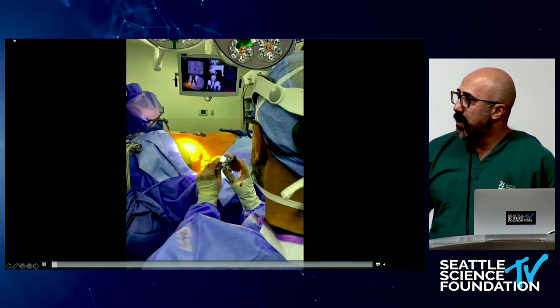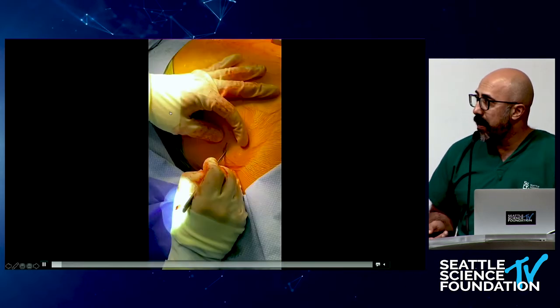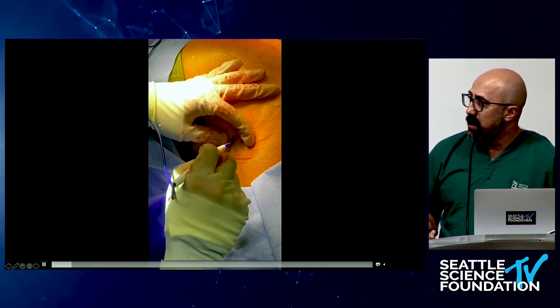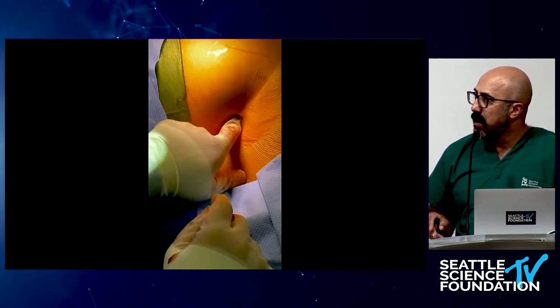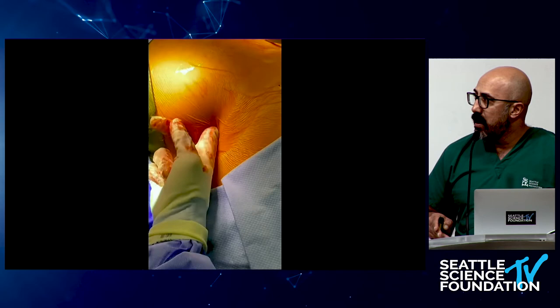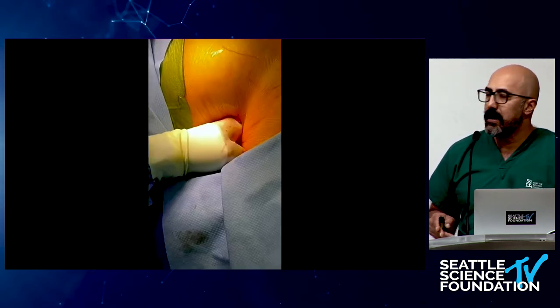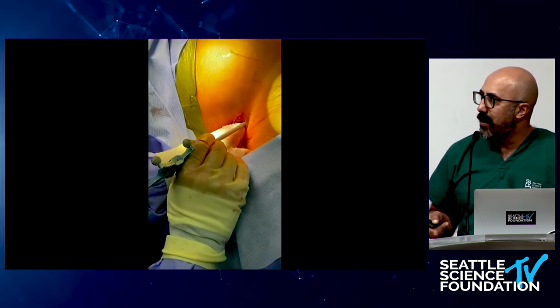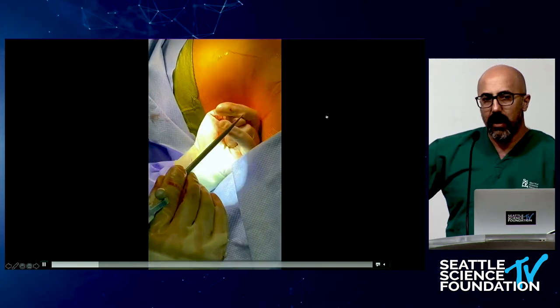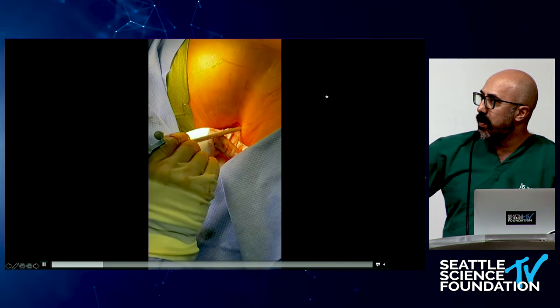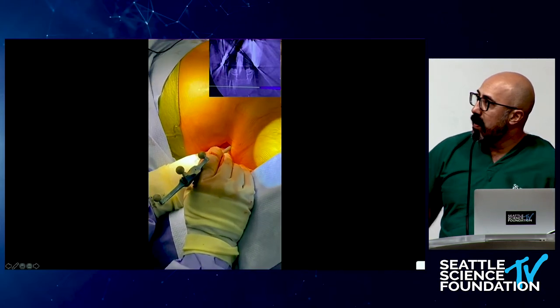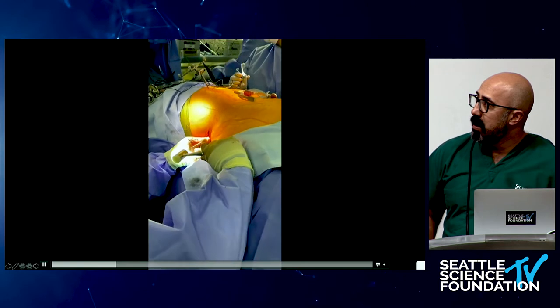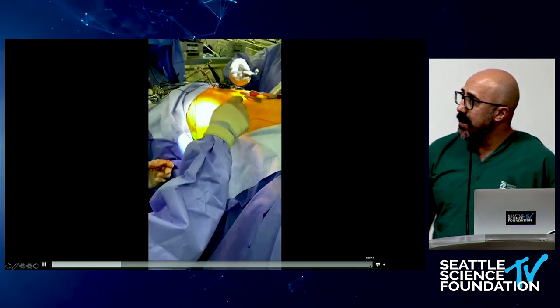I plan out the incision just like normal — this is a fairly large patient, working at L4-5. I come in doing blunt dissection through the skin. I treat this like a normal XLIF or normal lateral, blunt dissection all the way into the retroperitoneal space. I use a solid shank dilator — I don't like K-wires with navigation — and I navigate it into the disk space. You can see me go into the disk space right there.